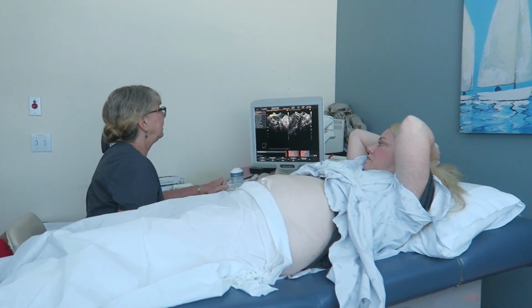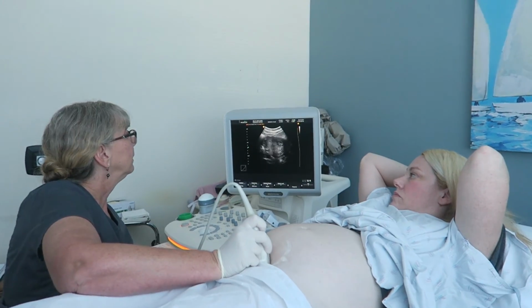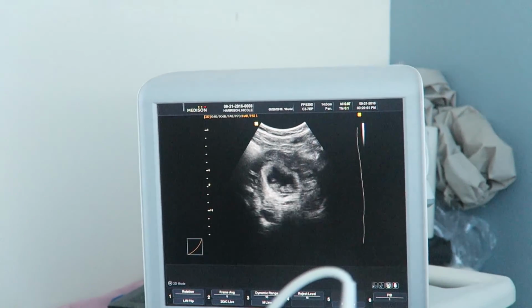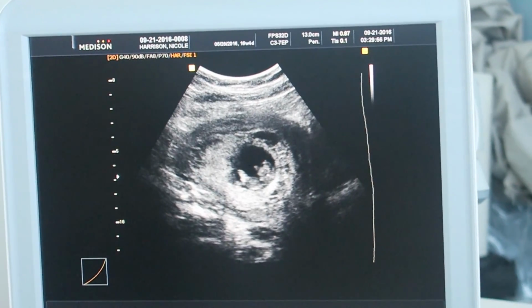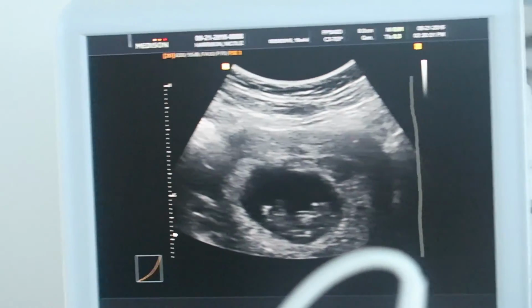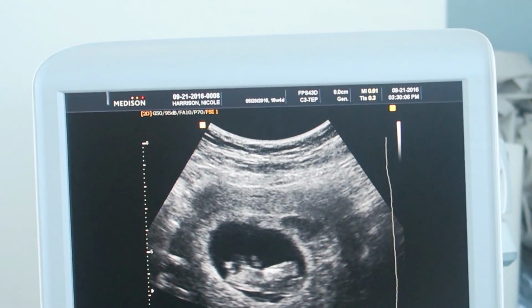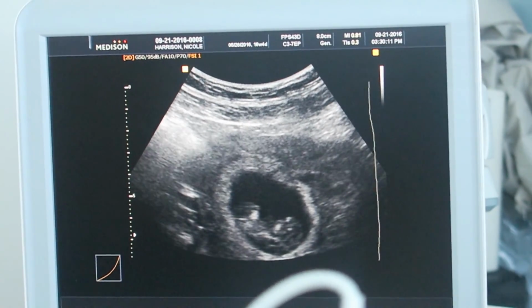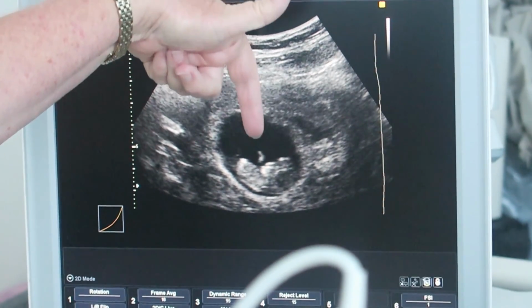All right, come back the other way. In pregnancy, there's just different issues at different stages, and we scan different on different stages. So this one's on the side looking up towards your heart. I'm trying to get the front of the face. Make it bigger, just move it around. Make it a little grayer. When I first started, I had a little bit of the front profile. Still a little too deep. So always the top of the screen is where the probe is. So we're scanning through you and through your little one.